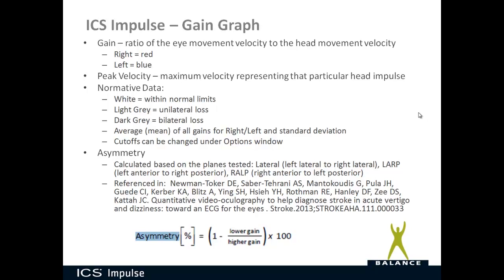The peak velocity shown at the bottom represents the maximum velocity for each particular head impulse. The normative data cutoffs can be changed in the options window if you collect your own normative data. The cutoff was originally 0.6, then raised to 0.8 in version 1.2 based on reanalysis of a large global dataset by Ian Kurthois, establishing 0.8 as the current cutoff between normal and abnormal.